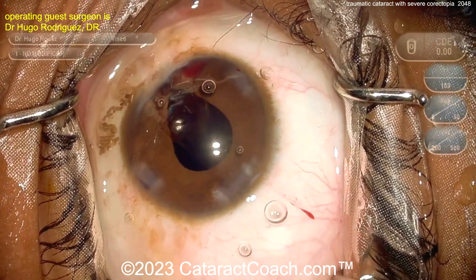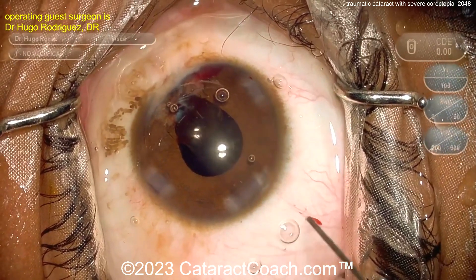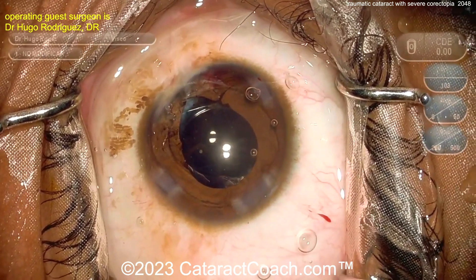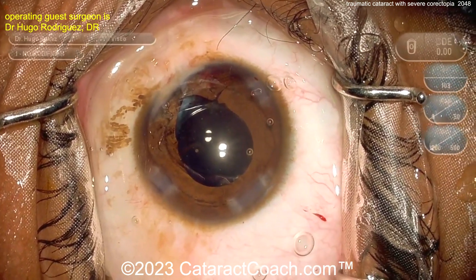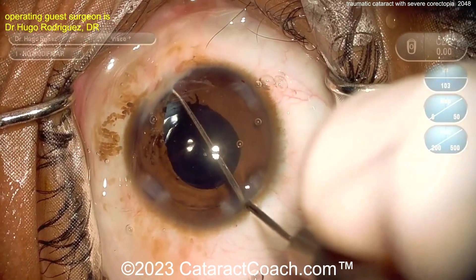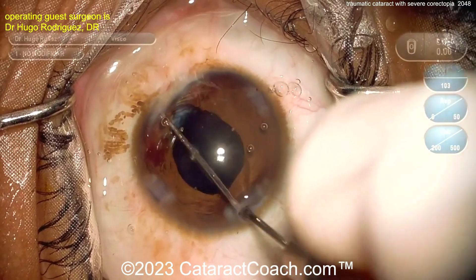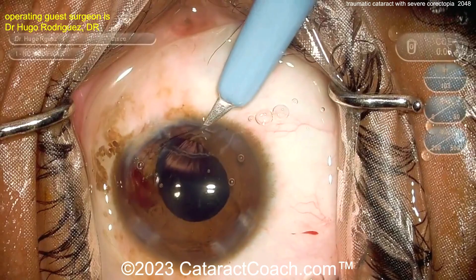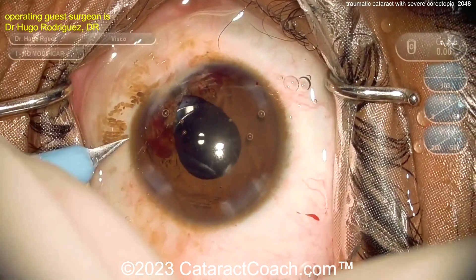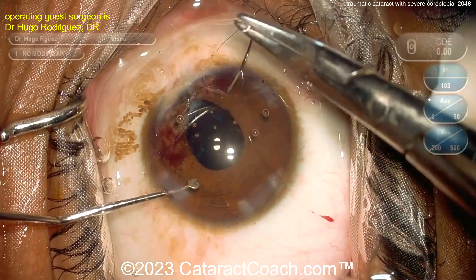Earlier the surgeon was smart to cut away the adhesion from the iris to the cornea. Now we're going to do a pupilloplasty, which is not a difficult procedure. The eye is filled with viscoelastic, which will make access for the pupilloplasty much easier. Going in with a blunt instrument to make sure no more adhesions remain. You could also use a gonio mirror or gonio prism for a better view.